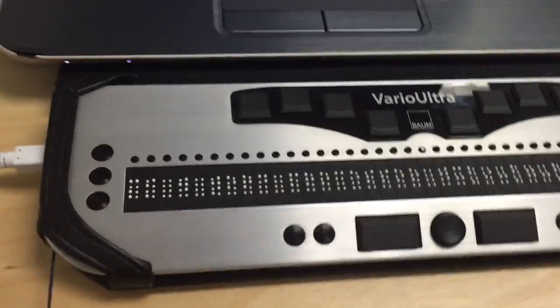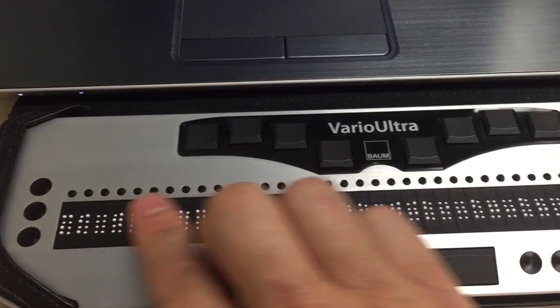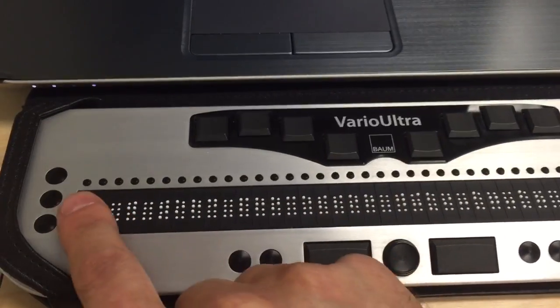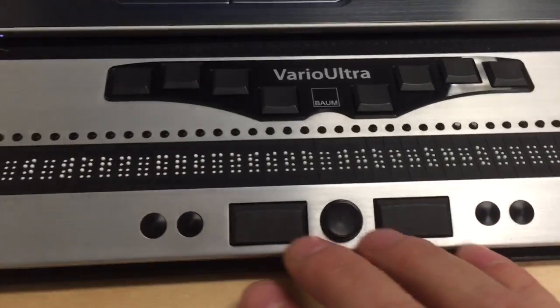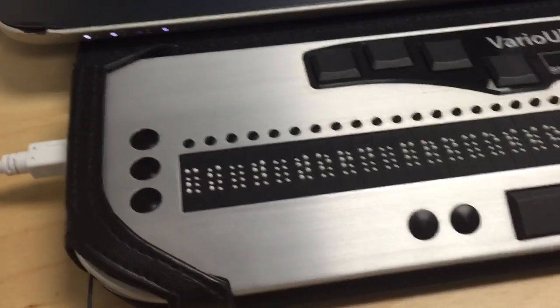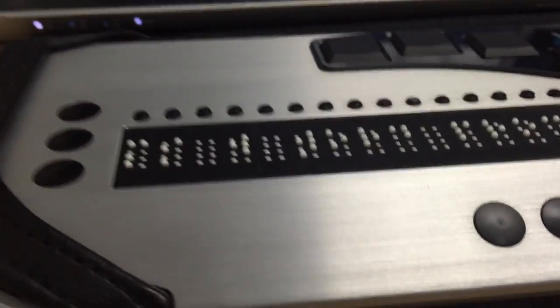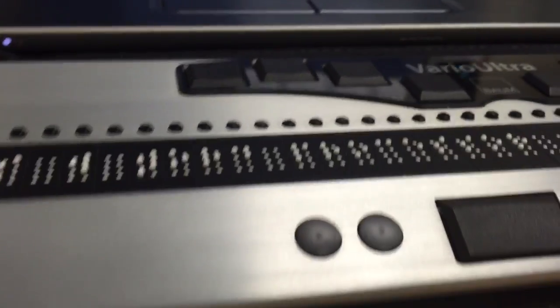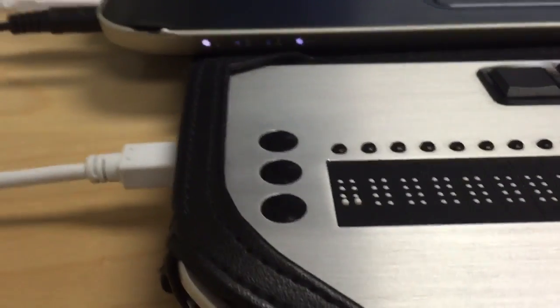I'm going to revert back now to the 40-cell Vario Ultra. As you can see, the layout is pretty much the same — the only difference is that we have twice as many braille cells. You still have the same display buttons to the left and right of the braille display, and the space bars, NaviStick, and so forth along the front. Right now I'm in braille note taker mode and I can see it's in grade one braille. I'll hit the left space bar to go into the word processor.